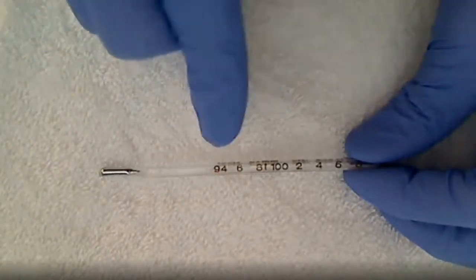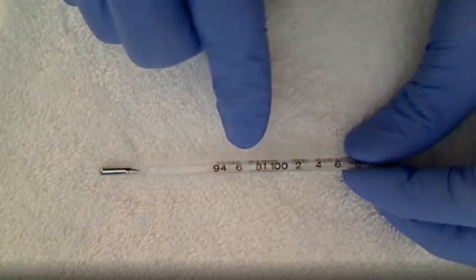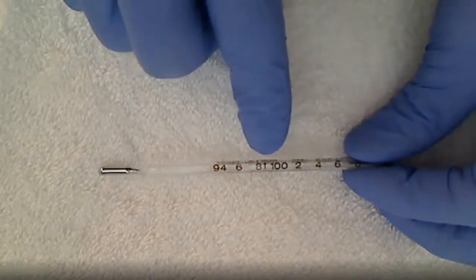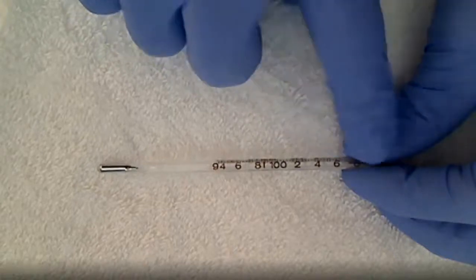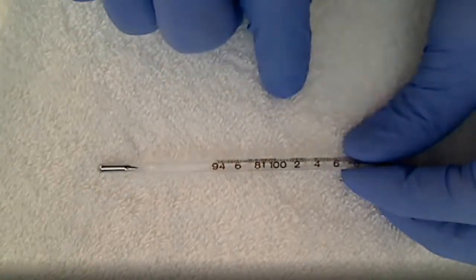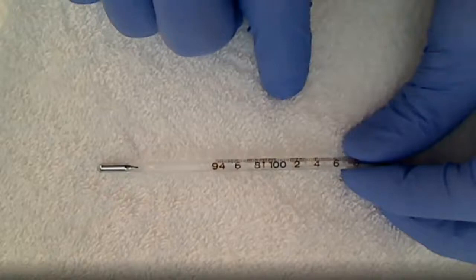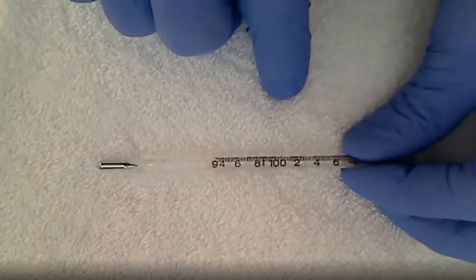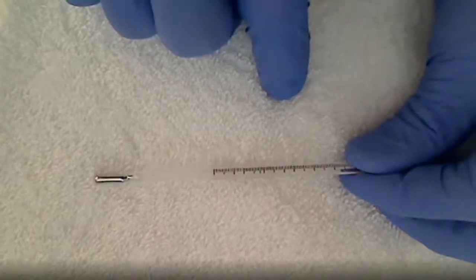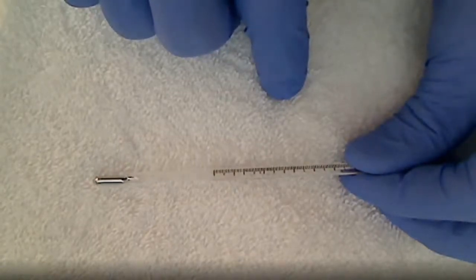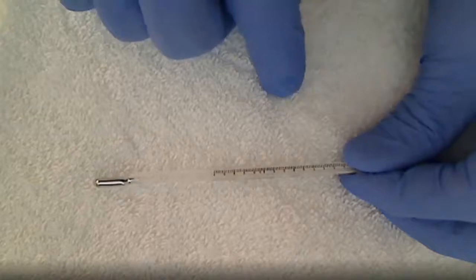Where it says 94, 6, 8, there's the arrow, 100, 2, 4, 6, and 8's up here under my thumb. You see all the little bitty marks right there? See them? It's tiny. That's why we can't put all the numbers on here.